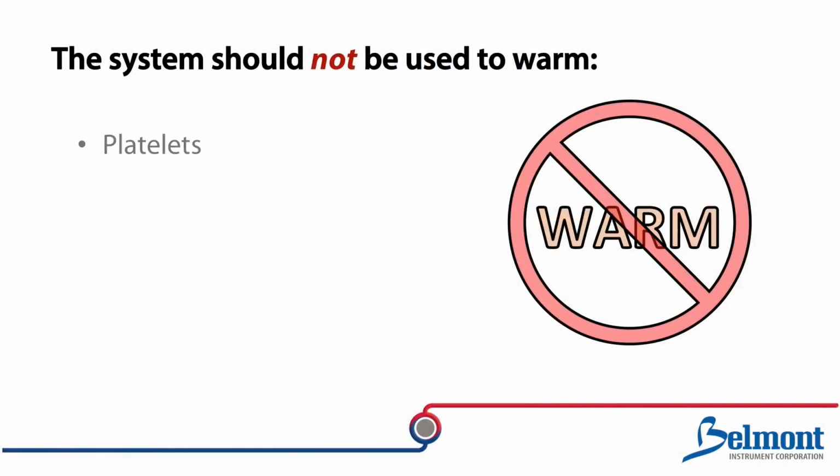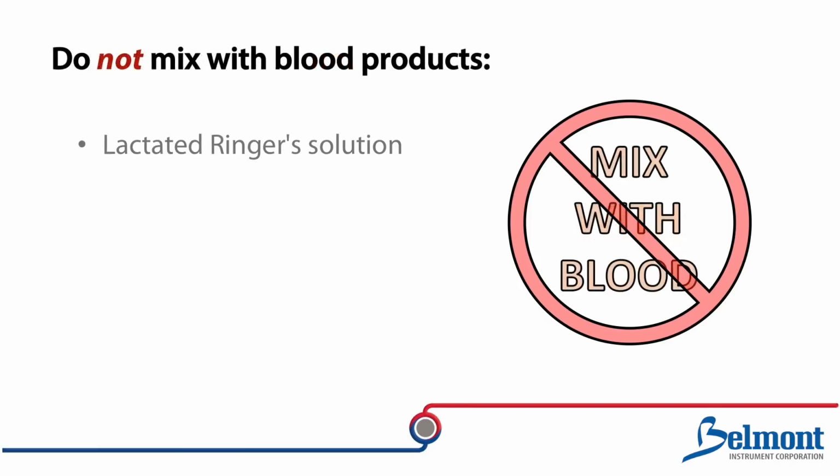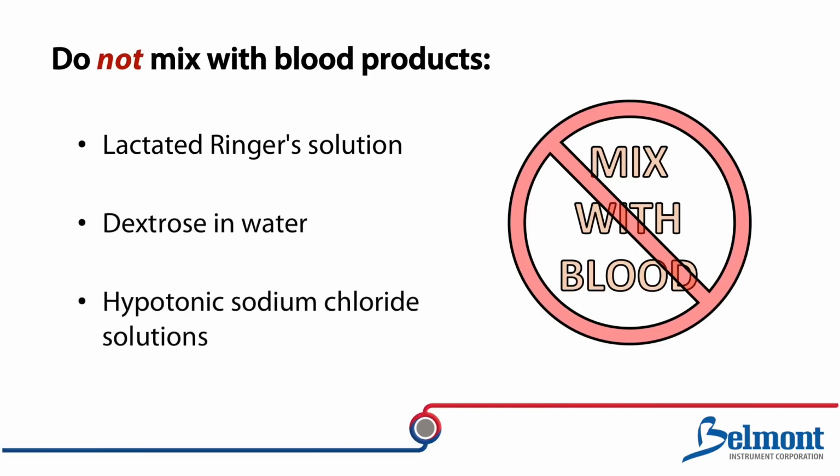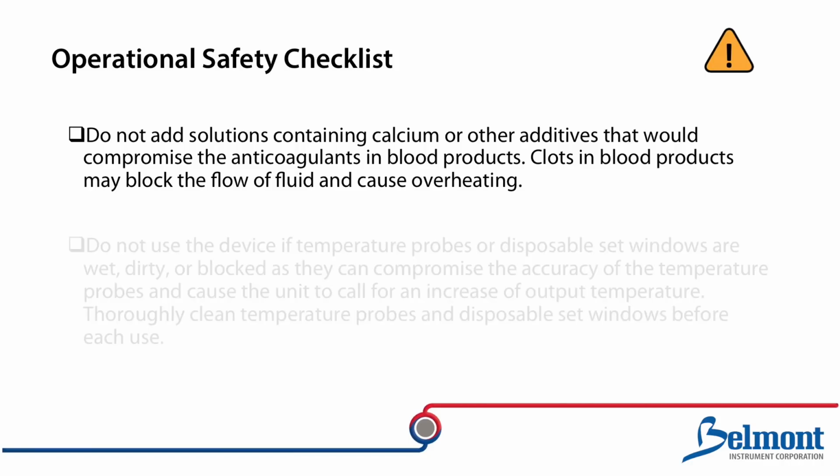The system should not be used to warm platelets, cryoprecipitates, or granulocyte suspensions. Lactated Ringer's solution, dextrose in water, and hypotonic sodium chloride solutions should not be added to blood components. Do not add solutions containing calcium or other additives that would compromise the anticoagulants in blood. Clots in the blood products may block the flow of fluid and cause overheating.